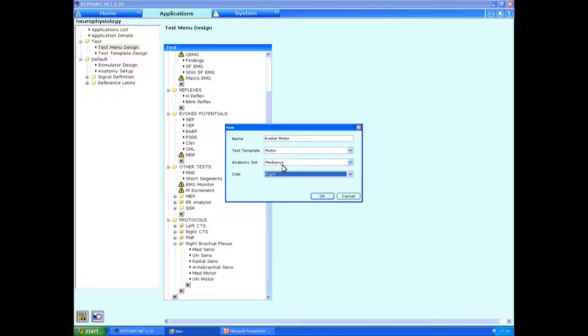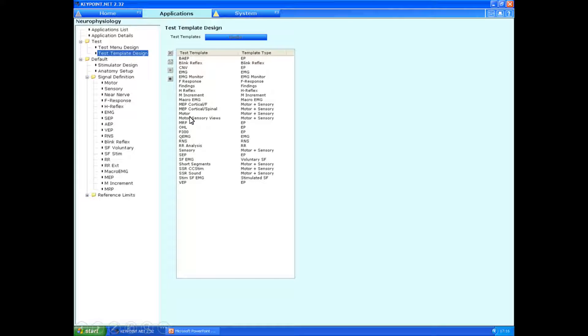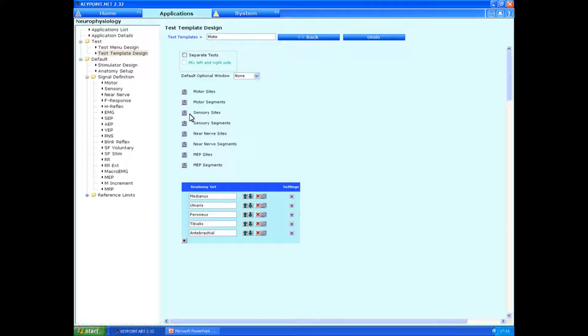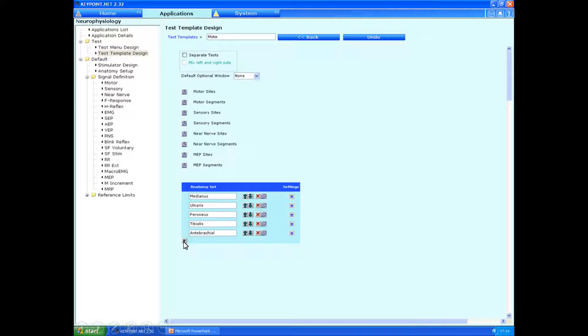So the way we're going to do that is very simply by going to the left side of the bar and click on test template design. This brings up all the different test templates, and we're going to choose motor. In the anatomy set here, you will not see the radial nerve. And this is what we're going to add now by clicking on the small little star over here.